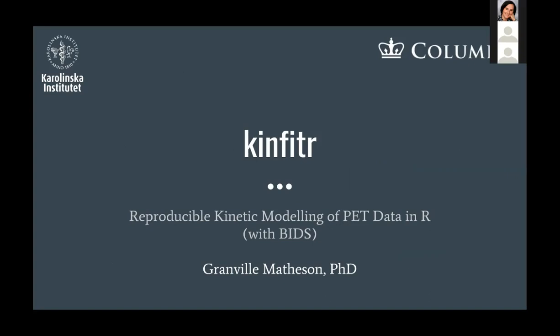So getting back to what Graham said earlier, hopefully all PET imaging tools will be able to just read BIDS data in, and Kinfitr can do this already. Hopefully this will become a reality in future, so that we can basically select whichever tool we want to use. So firstly, I'll discuss quickly what Kinfitr is.